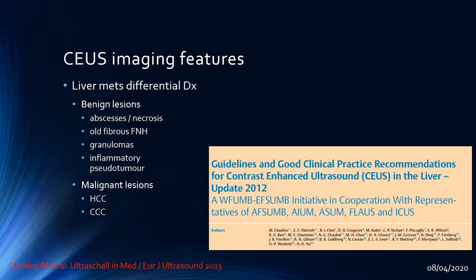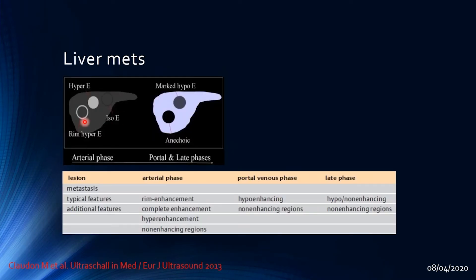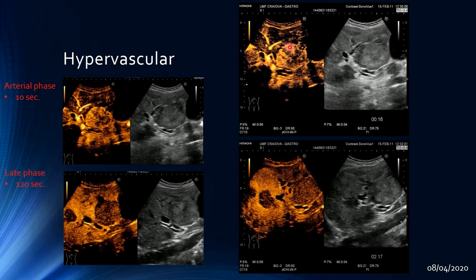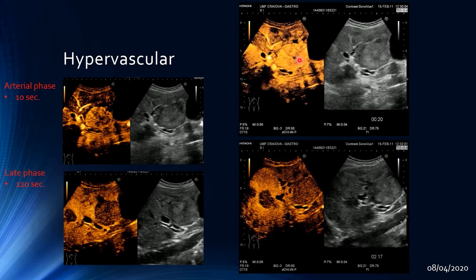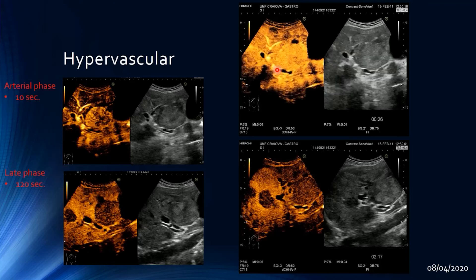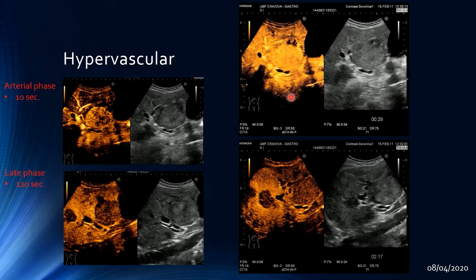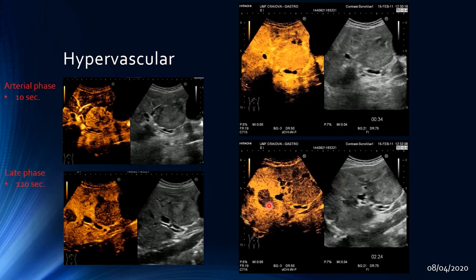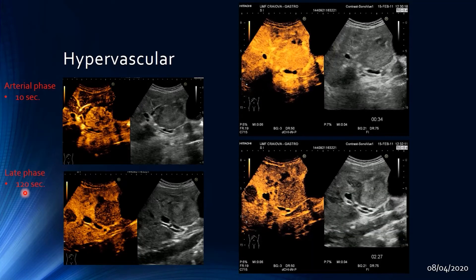Liver metastases can be hypo-, iso-, or hyper-enhanced in the arterial phase, sometimes showing ring-like hyper-enhancement, and then appear anechoic or markedly hypoechoic in the portal and late phases due to profound washout. An example of a hypervascular liver metastasis shows a large lesion in the left lobe that is hyper-enhanced in the arterial phase, with multiple lesions showing washout after 120 seconds.